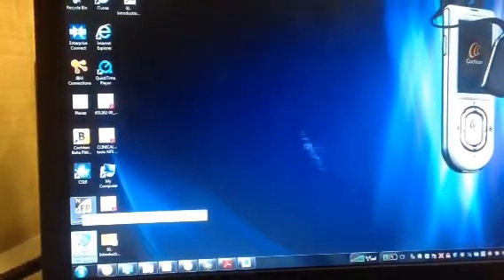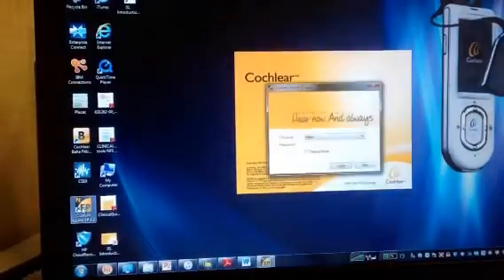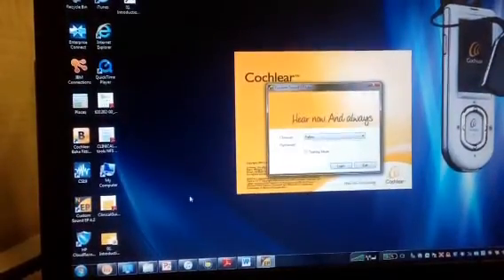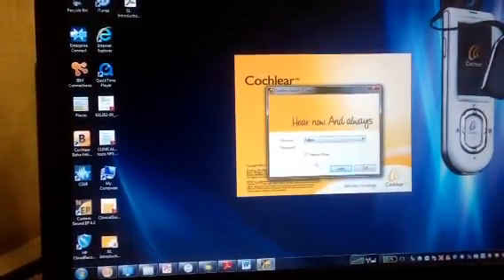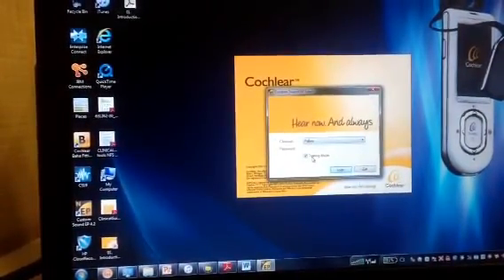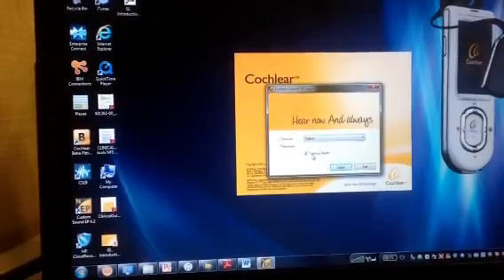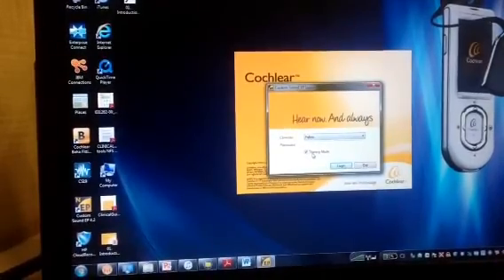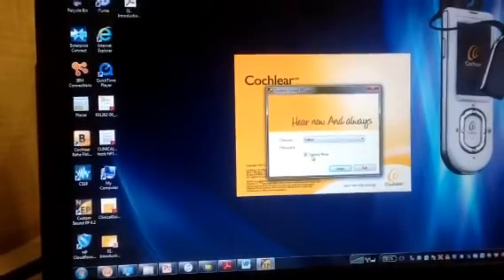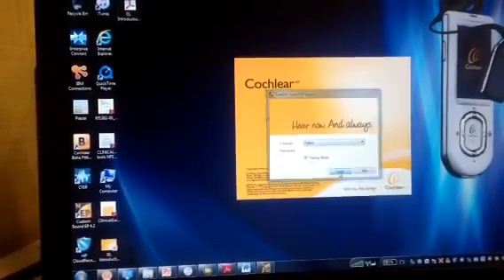You would open Custom Sound EP. In Custom Sound EP you will go into training mode right now, but when you are actually doing it on a patient you would not use the training mode. You say login.